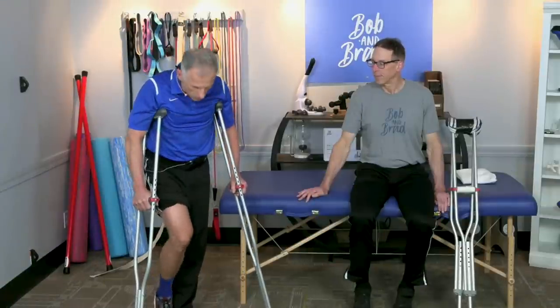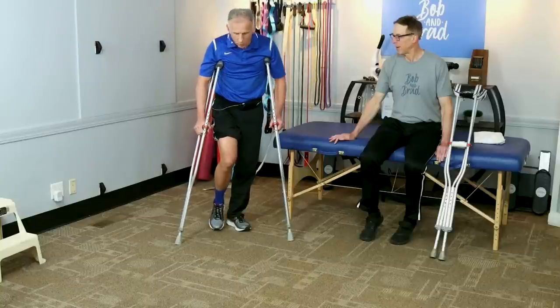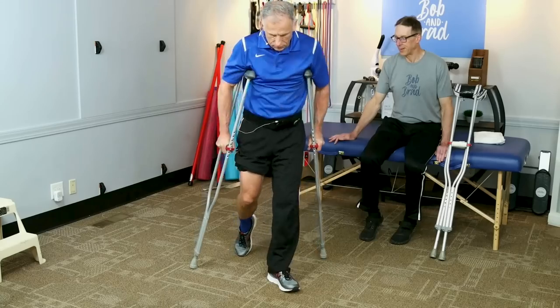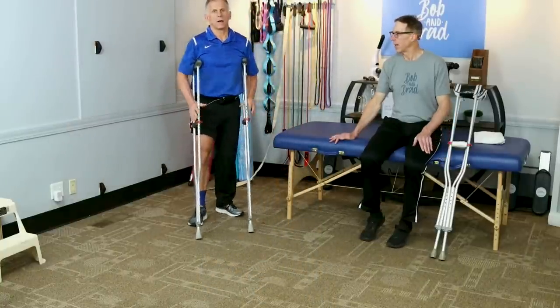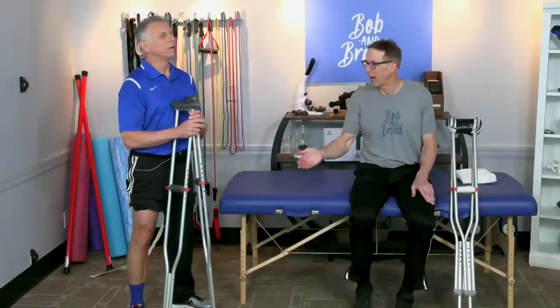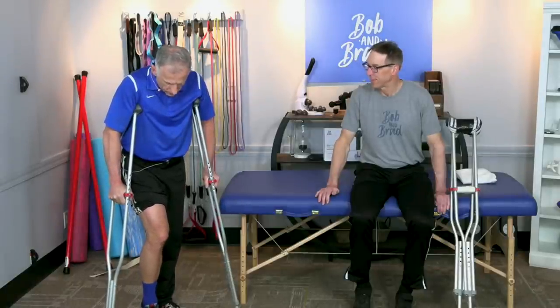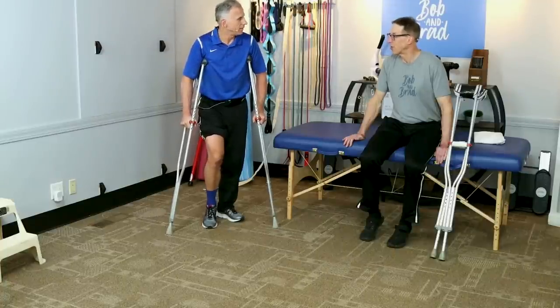Another scenario: the doctor says you can put a little weight on it but not full weight — called 'weight bearing as tolerated.' If there's no pain, you can put a little more. The sequence is really the same: go forward with the crutches and swing through, just touching with your toe at maybe 25% weight bearing. If the doctor gives a specific weight limit — say 20 or 40 pounds — use a regular bathroom scale. Put your foot on it and push down until you reach that number so you know exactly what it feels like.